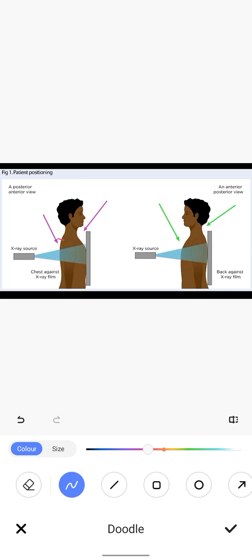And the front side of the body is called anterior. So here this one is posterior and this is anterior. In this image, this one is anterior and this is posterior. For the anterior, we will use A, and for the posterior, we will use P.